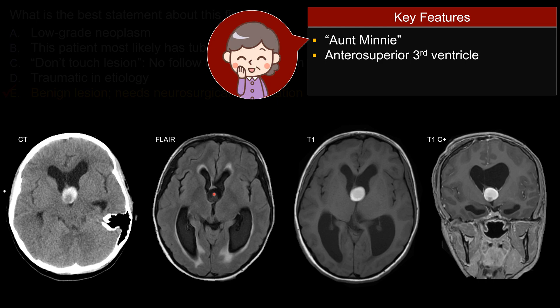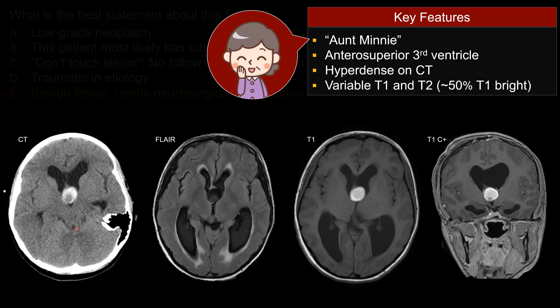That's its classic location. It is typically hyperdense on CT, and sometimes incidentally on trauma scans it can be mistaken as hemorrhage, as in this case. Typically it's bright on T1 — at least 50% of the time it's bright on T1. Some can be a little bit isointense on T1.